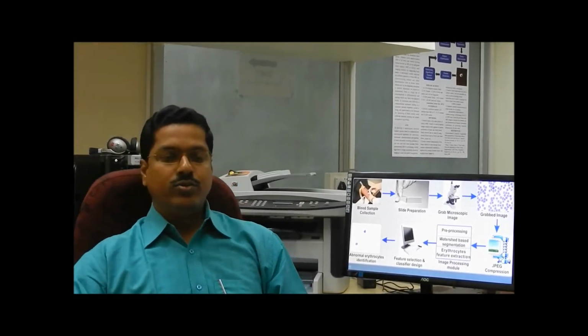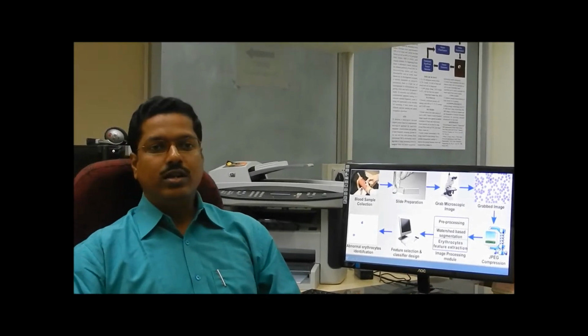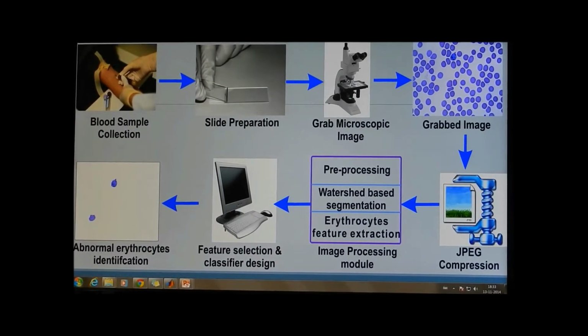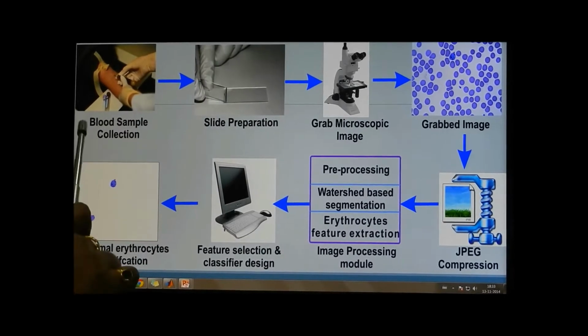Biostatistics and Medical Informatics Laboratory at IIT Kharagpur has recently developed automated malaria disease detection software. The software will be used to screen only malaria parasites from whole microscopic images.